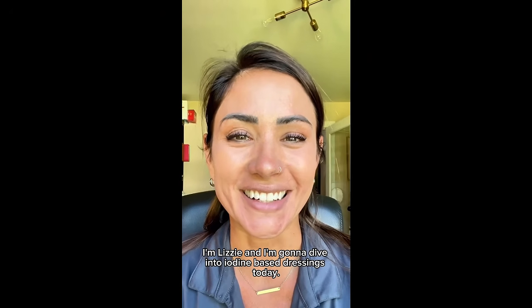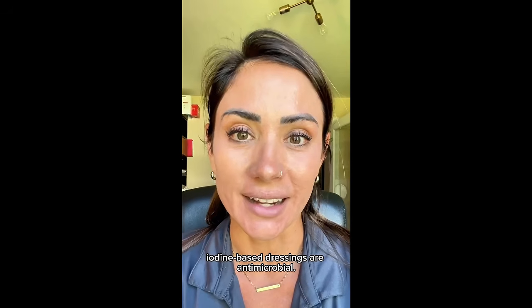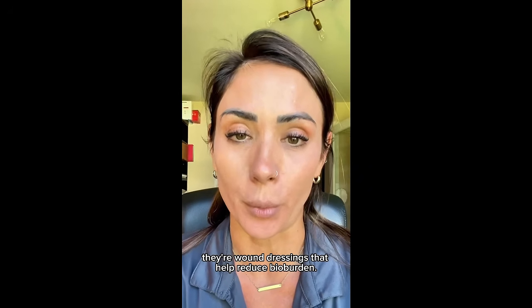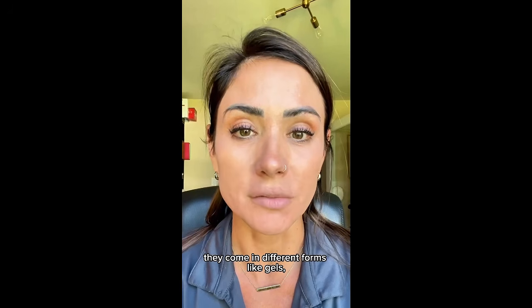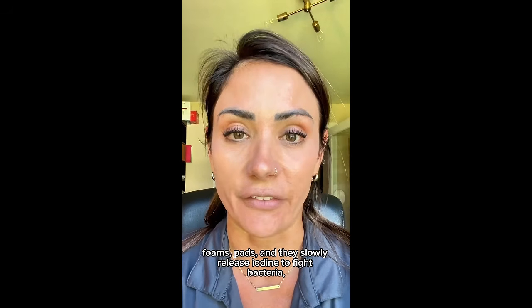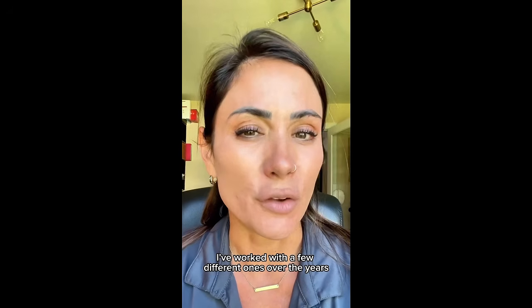I'm Lizzie, and I'm going to dive into iodine-based dressings today. So we're going to start with the basics. Iodine-based dressings are antimicrobial wound dressings that help reduce bioburden. They come in different forms like gels, foams, and pads, and they slowly release iodine to fight bacteria, fungi, and even viruses. I've worked with a few different ones over the years.